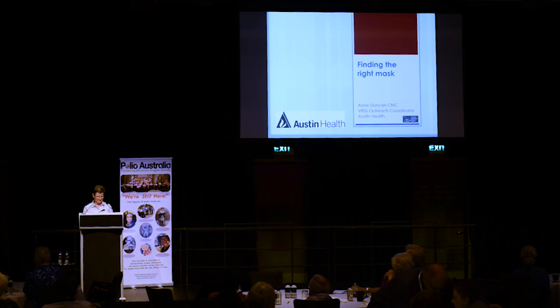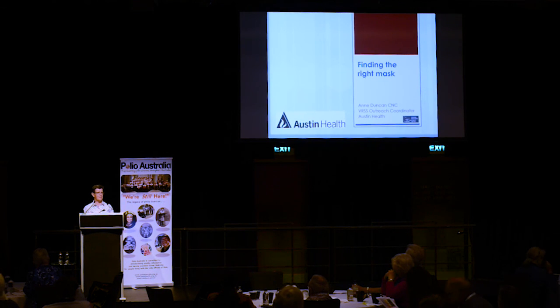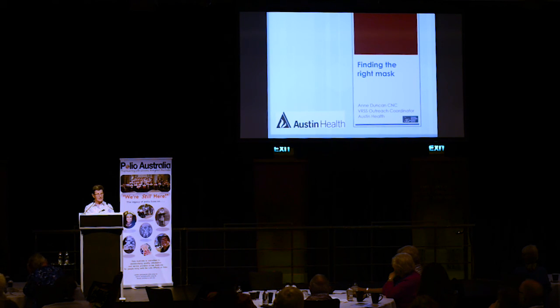I certainly did. So today I'm just going to be talking about finding the right mask for non-invasive ventilation. In some instances, a non-invasive ventilation mask would be the same as a CPAP mask, but in other instances, if you're using volume ventilation, you would need a different mask. So, finding the right mask to use with non-invasive ventilation can be fraught with difficulties. There are many types, models and sizes, and each have advantages and disadvantages.